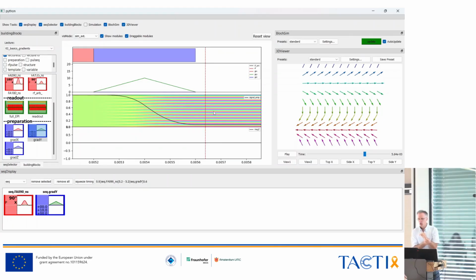And if we look at the sum of our signal, this goes down. So that's this dark curve here, this black curve, that's giving the sum of all the magnetizations. And since they are now showing in all other directions, they sum up to almost 0.